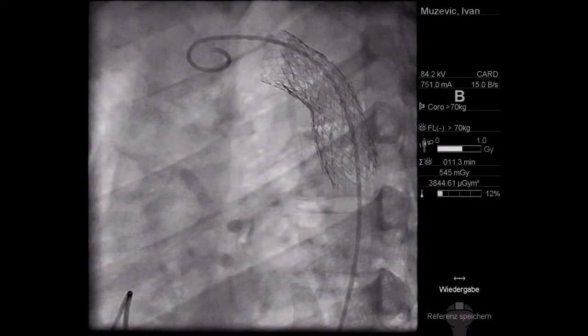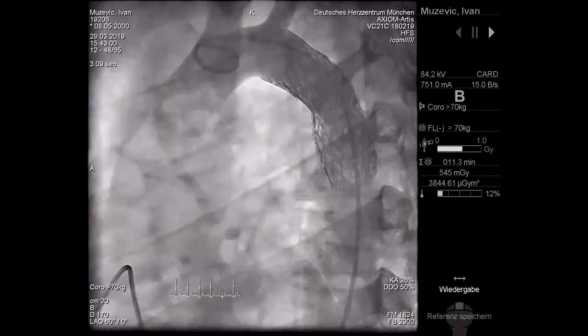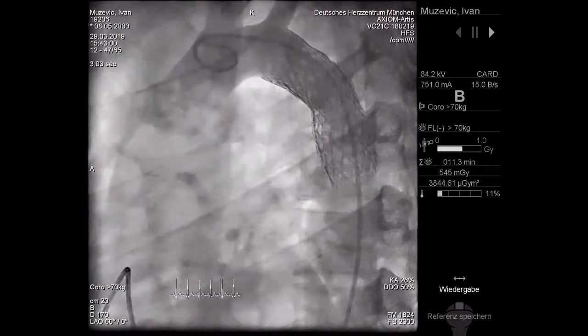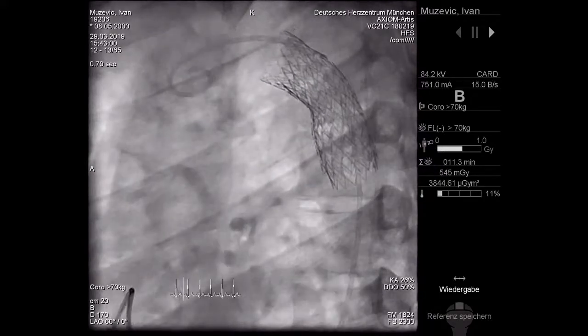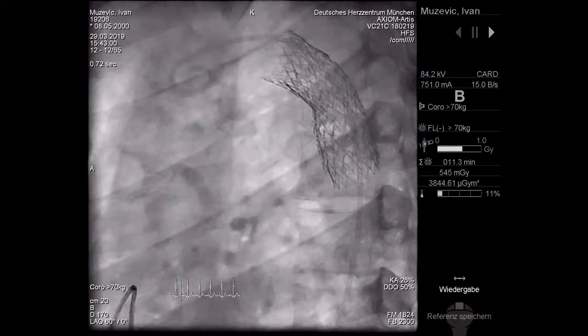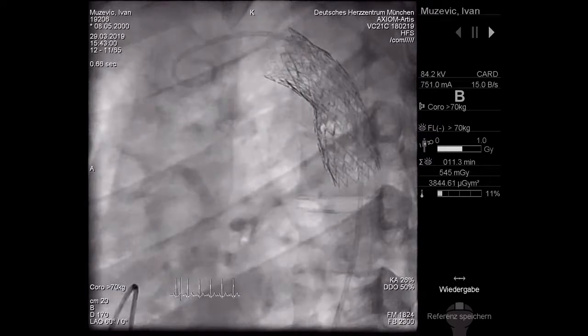It's good flow. Okay, Jacques, you mean in the angle of this stent there we should dilate it with 18 millimeters, right? Yes, correct, and squeeze harder. Squeeze harder. You have to squeeze your buttocks as you inflate. I had a very weak lunch, you know, but we'll try it now.